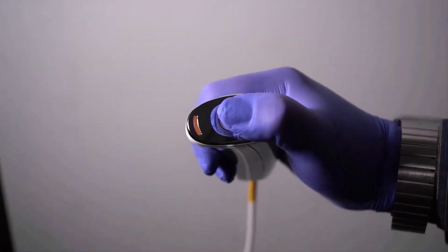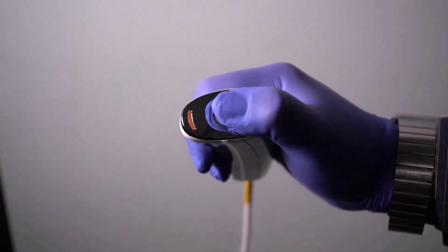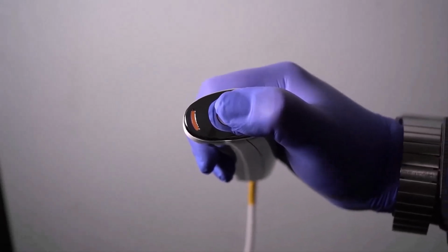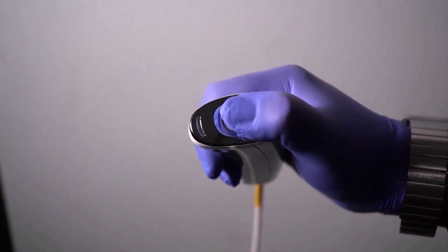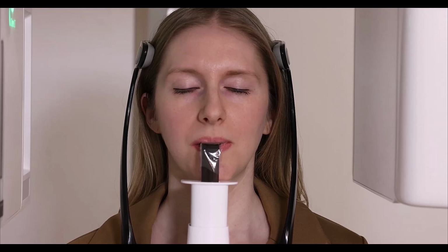Hold the button on the acquisition trigger switch, which will turn yellow when exposing. Hold the button until the image acquisition is fully complete. Image capturing is complete. Please wait a moment. Please open your eyes and follow the operator's instructions.